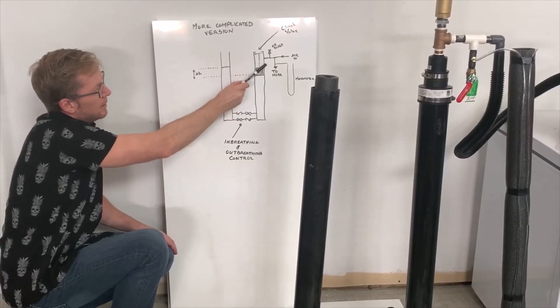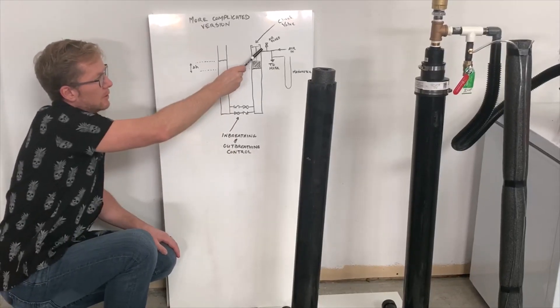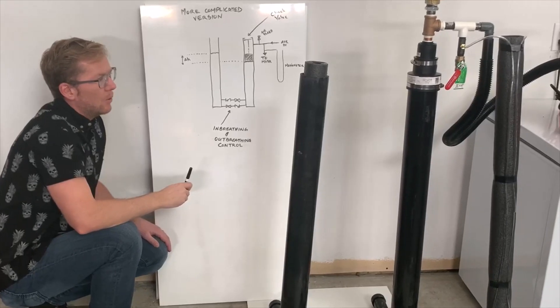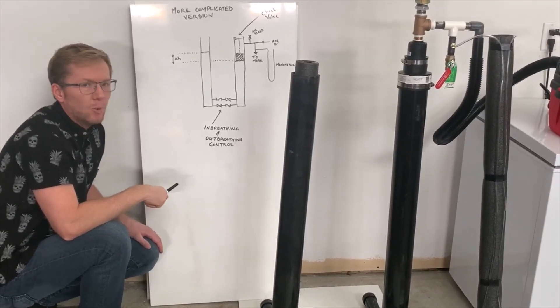We also added an air bleed as we're using a shop vac for the pressure source. This allows us to adjust the inlet pressure to the tubes. Now I will take apart the machine and show you a little bit more about how it works.